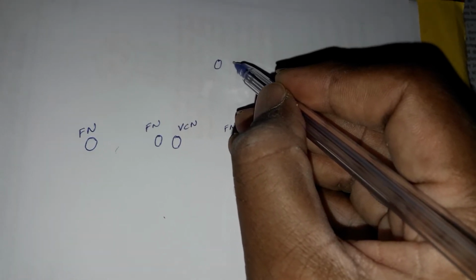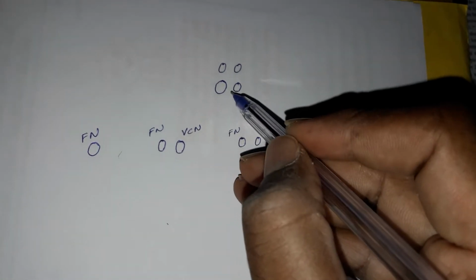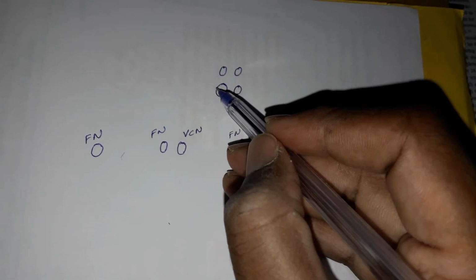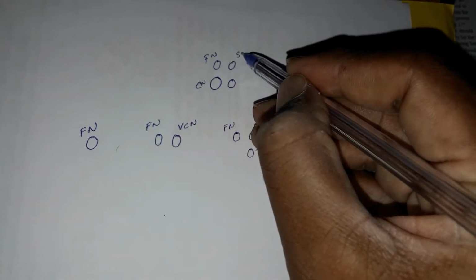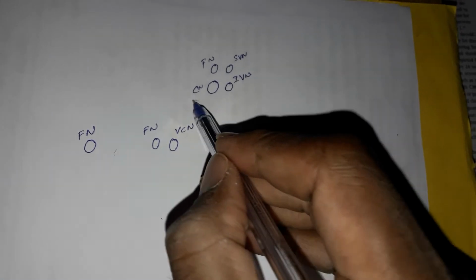Normal is facial nerve, superior vestibular nerve, inferior vestibular nerve and larger cochlear nerve. Larger means larger in diameter than facial nerve and superior and inferior vestibular nerves. So cochlear nerve is larger than facial nerve, superior vestibular nerve, inferior vestibular nerve. This is normal.